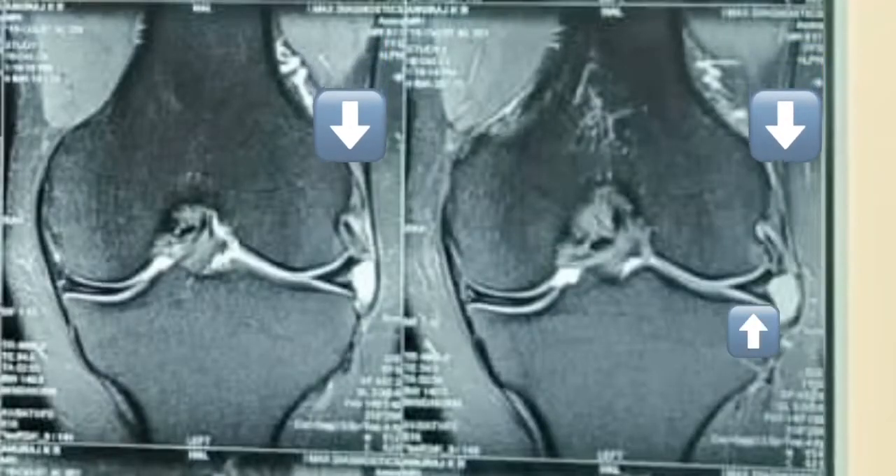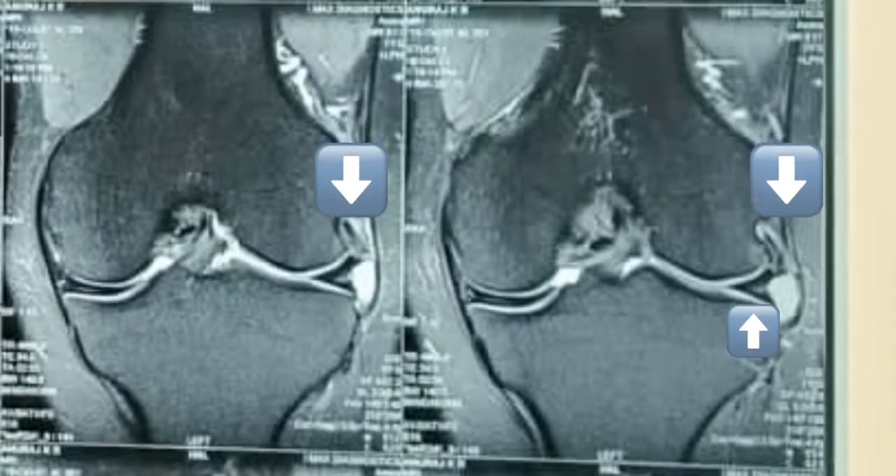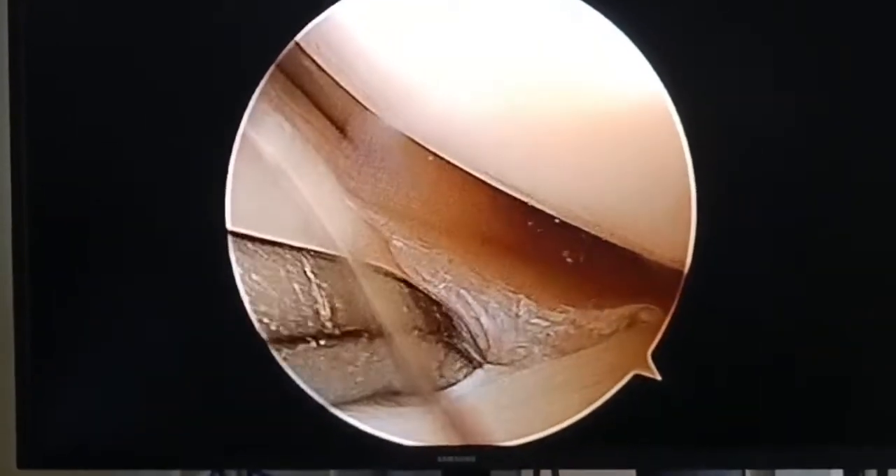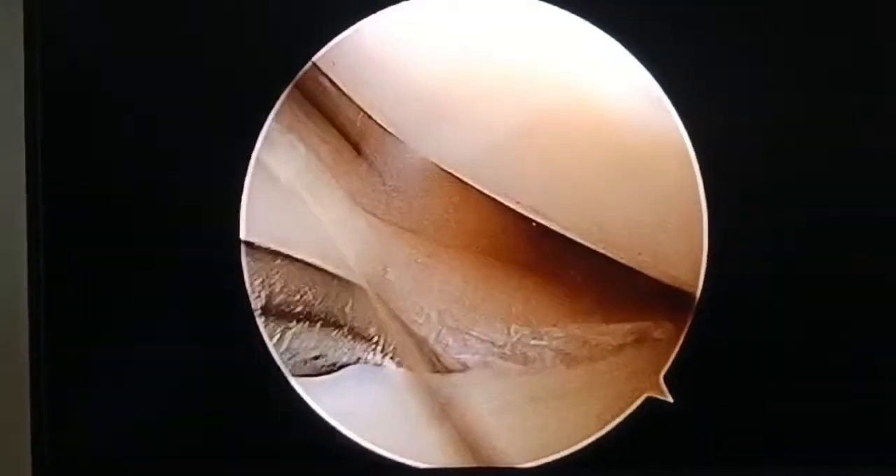This image also shows the horizontal tear, as you can see from the arrow which is pointing upwards. The diagnostic arthroscopy reveals the horizontal tear, which I am palpating right now with the probe.